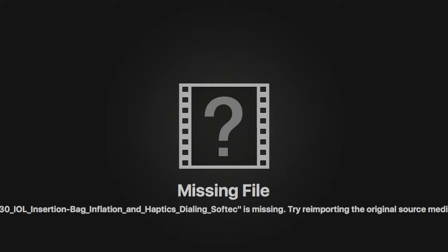It's only after both haptics are in the bag that I remove the Malyugin ring. Here, as you can see, I'm tucking the distal and proximal haptics into the bag.